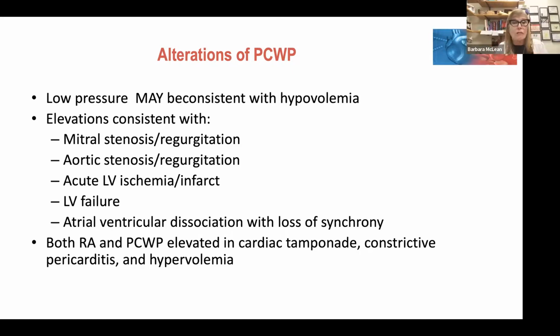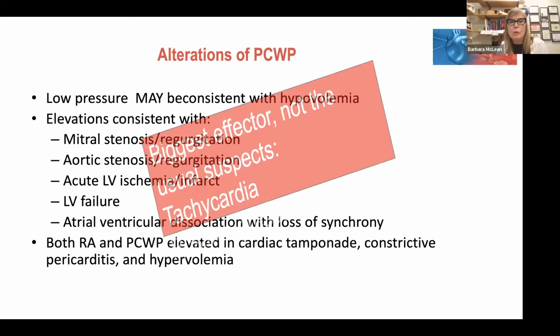LV infarct, LV ischemia, LV failure, dissociation, same as what you talked about on the right heart side, just remembering that there's a delay in the transmission of the waveforms and that the wedge pressure is very indirect for looking at left heart, okay?